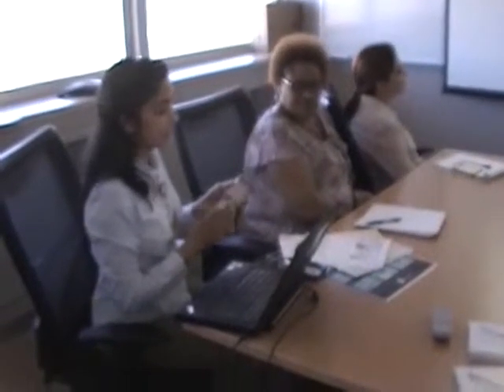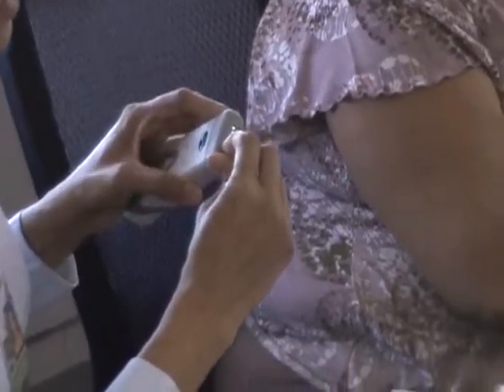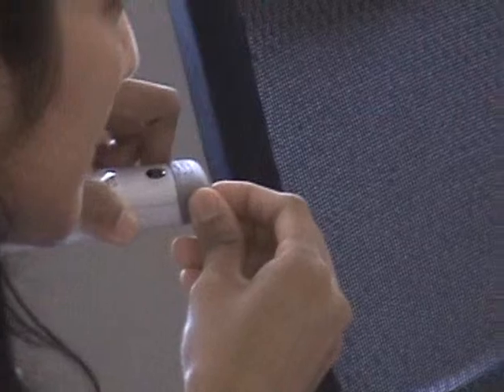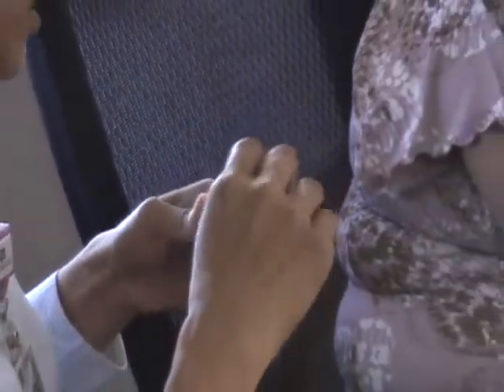Second troubleshooting tip, change the battery. I already told there is a battery, so you can just take your battery out if your battery charge is less than 2. So you can always push this small button and make sure it has 4 green lights on. If it is less than 2, take it out and put a new battery. So this is the battery, and reinsert a new battery.